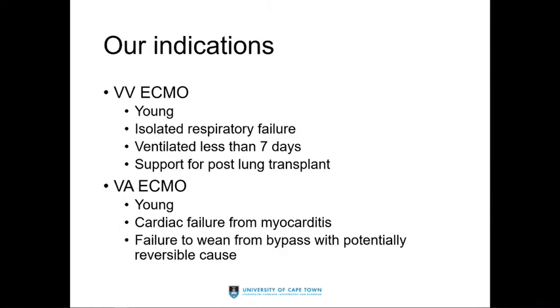Isolated respiratory failure. We don't take patients who have ventilated more than 7 days on harmful ventilatory settings. And this is why we're not offering ECMO for a lot of the COVID patients, because they seem to deteriorate beyond the 7-day window, or we can get them there, but then they suddenly decompensate afterwards.